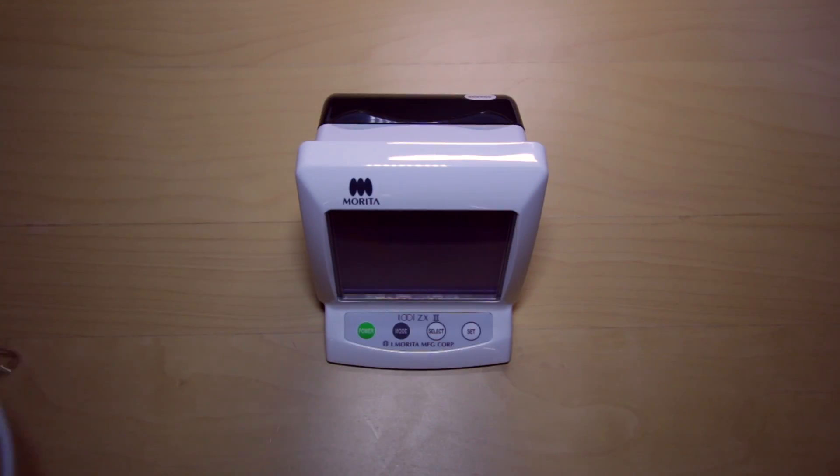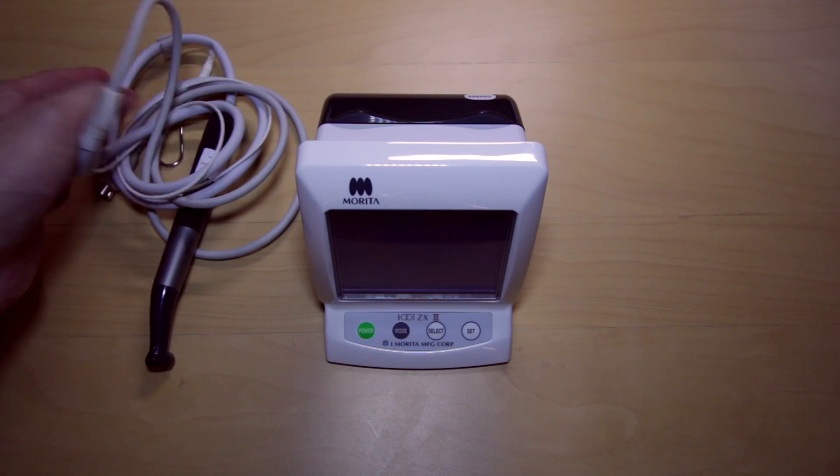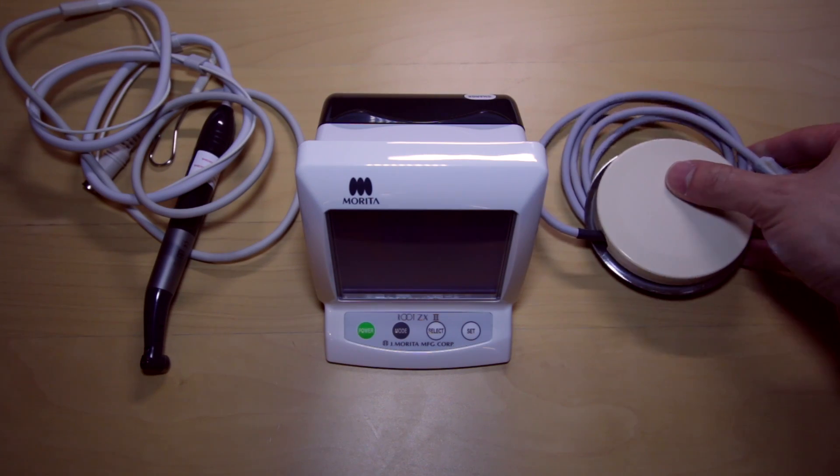You have your primary Root CX-2 device with the OTR module installed, handpiece, and foot pedal.